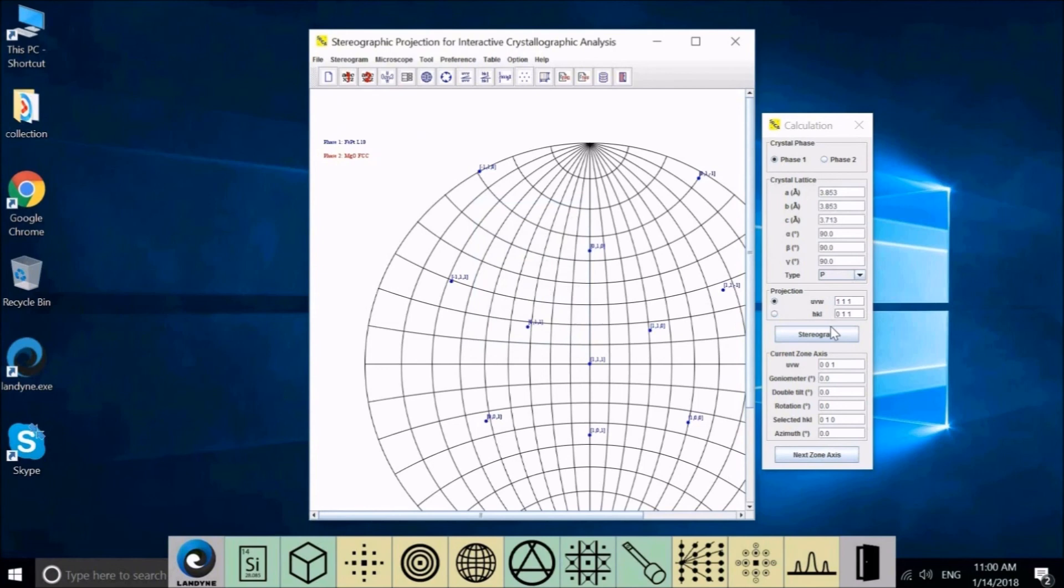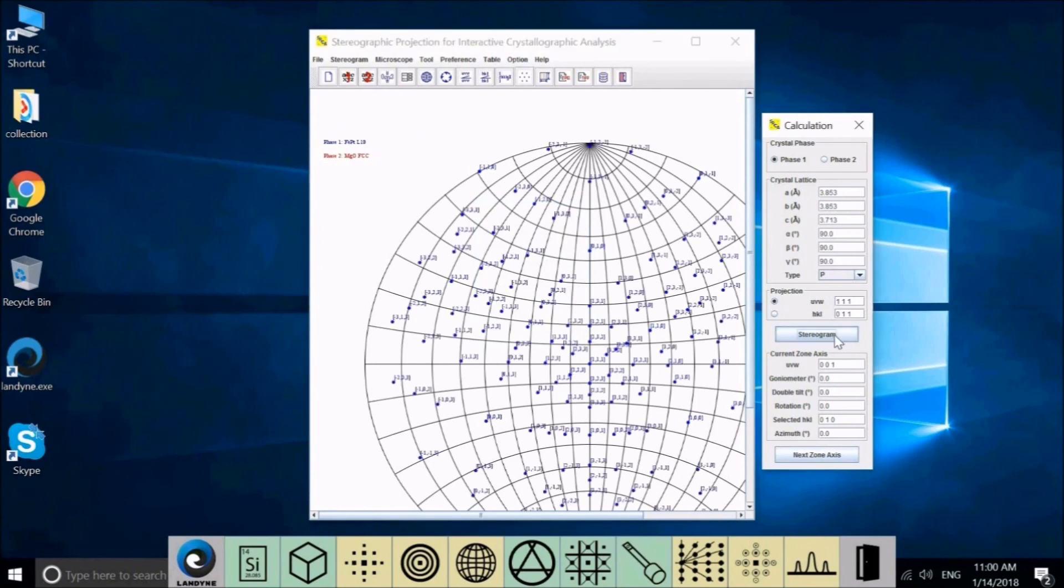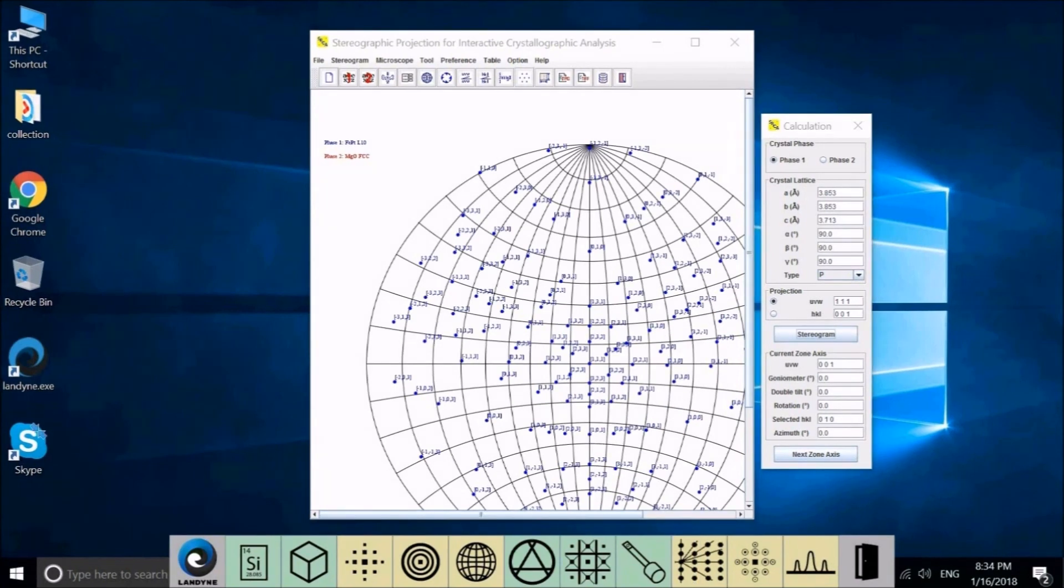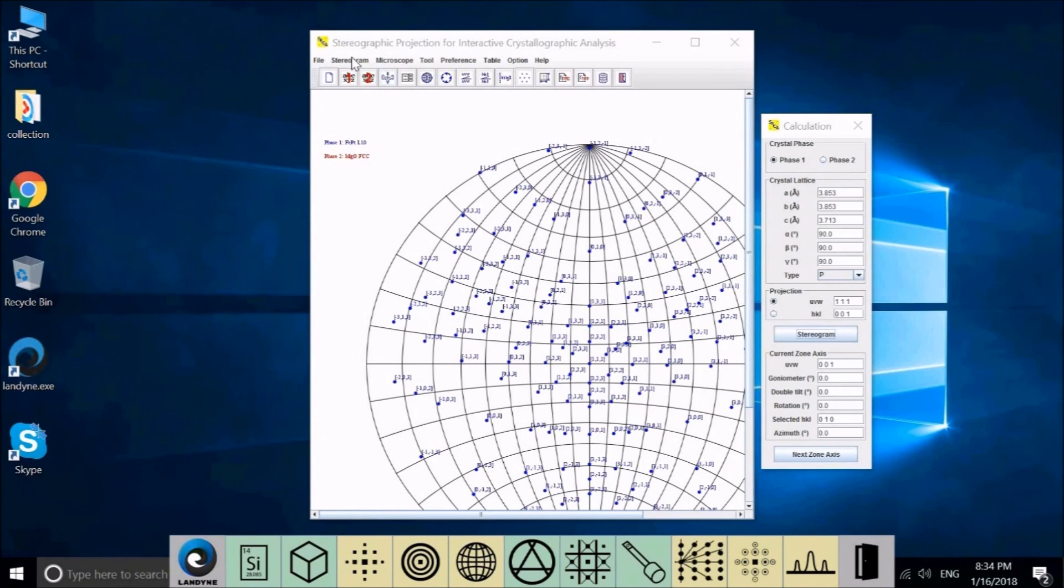Redo it again. You can see only very few pole points are here. Let's go back and you have a default here. Close. Redo it again.